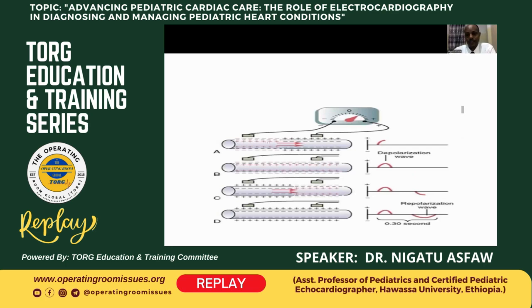This wave of depolarization and repolarization is recorded on ECG as positive and negative deflections, determined by the direction of the wave. If a wave of depolarization is moving toward the positive electrode, we get a positive deflection on the ECG machine or on the leads, and the opposite is true.